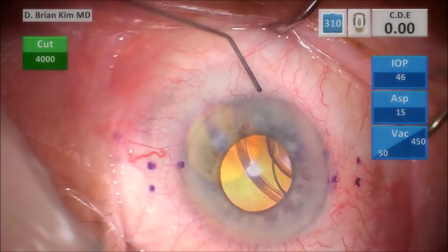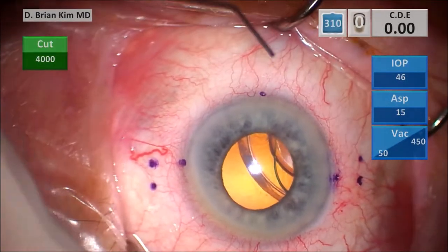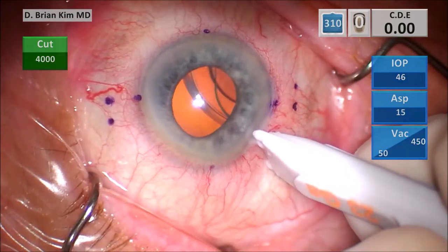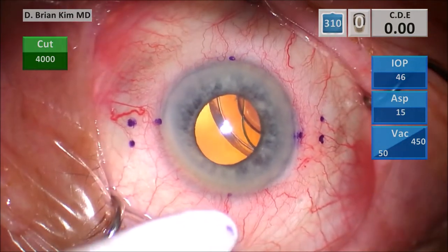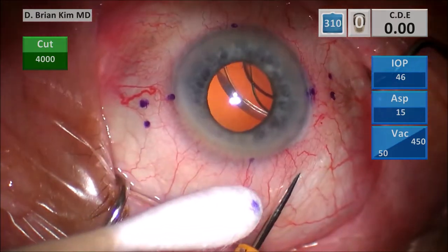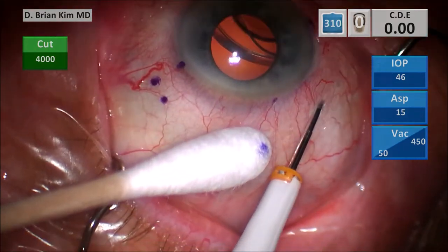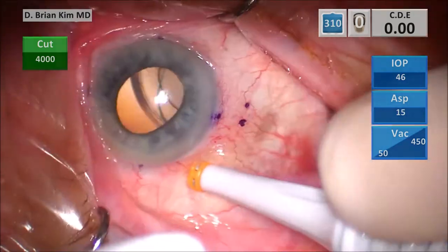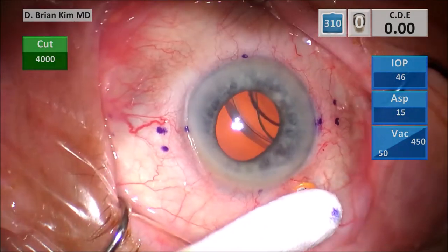I'm also marking contra-incisionally, and this is the indentation 4 millimeters posterior to the limbus for the trocar. I'm going to tunnel with the trocar needle, then turn 90 degrees and enter — you know that's a good entry because the trocar is sitting sideways a little bit.